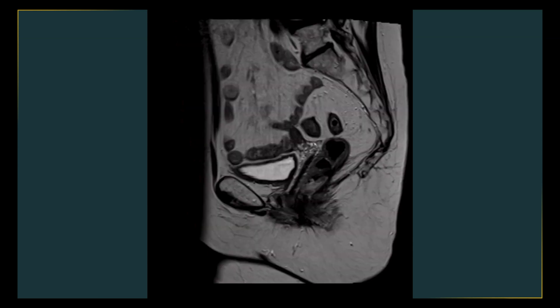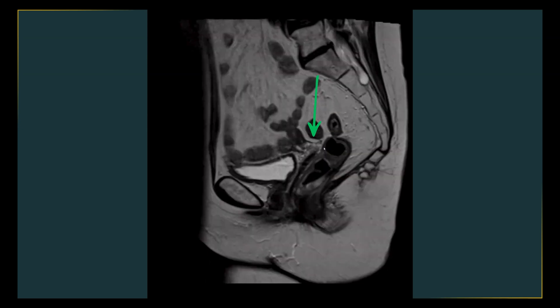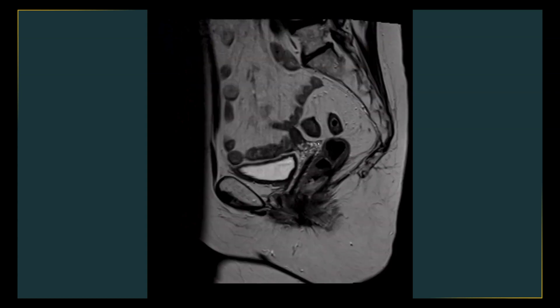So do you see this thin hypo-intense signal band just above the cul-de-sac? You can see that this is the uterus, this is part of the cervix, and you can see the cul-de-sac and the peritoneal reflection just above it. That's where the peritoneal reflection reflects over the upper part of the rectum to then move on to cover the rest of the pelvis.